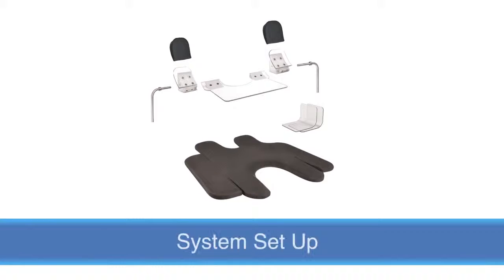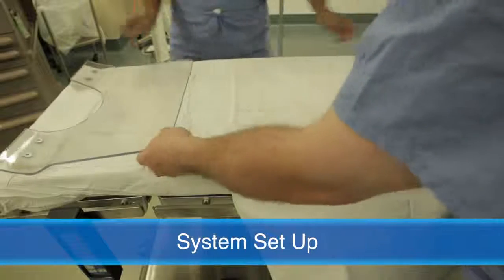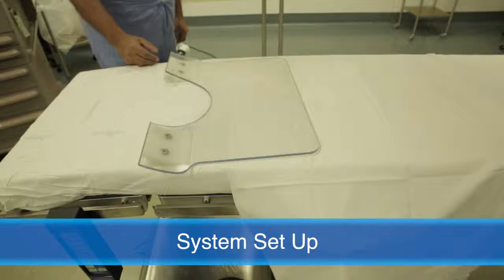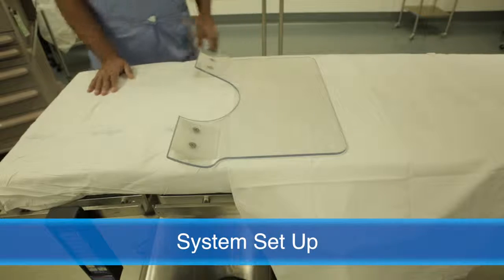Setting up the system: Place the TPS foundation onto the surgical table with the wedges toward the top of the table. Please note that a draw sheet can be used on the SecureFit TPS under the foundation, as shown here.